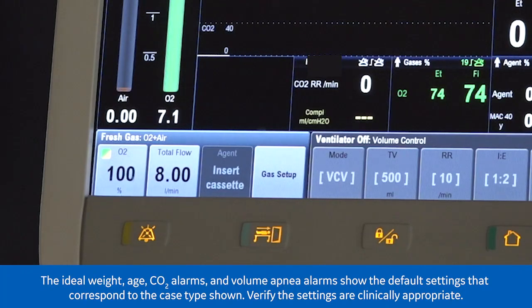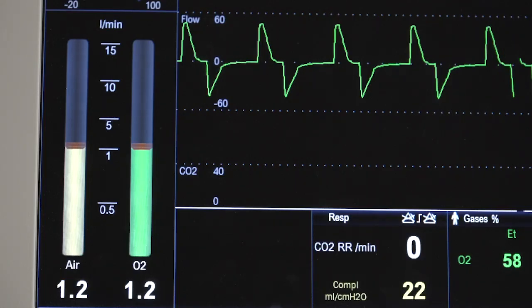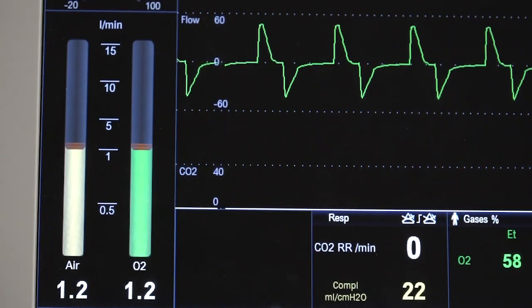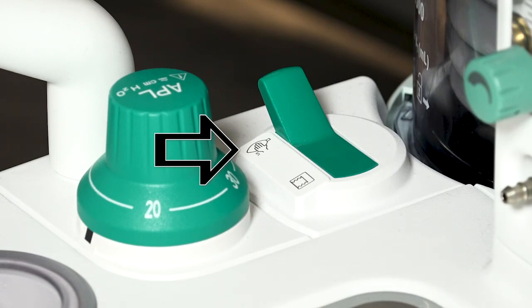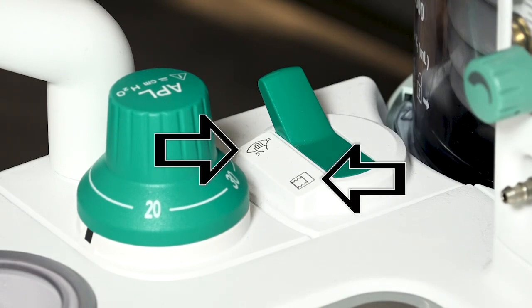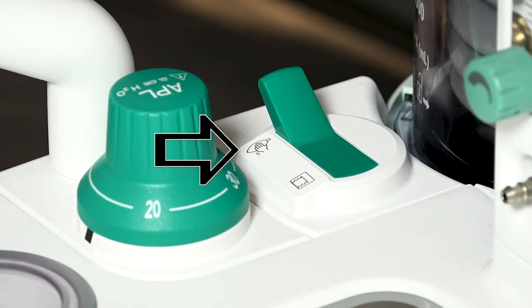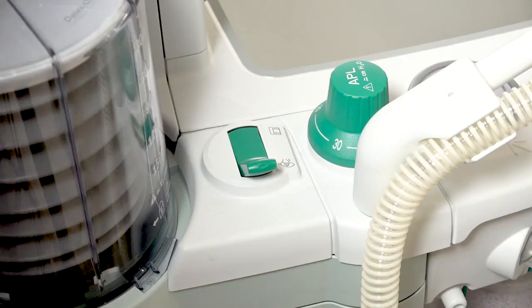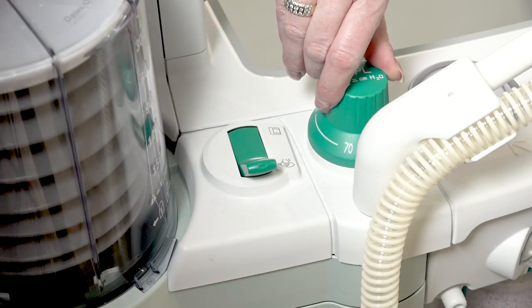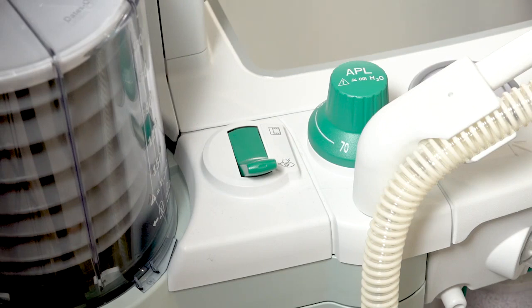When starting a case, always ensure gases are flowing. Anesthesia devices are not automatically configured to begin mechanical ventilation when a case is started. The devices are configured for both manual ventilation, often referred to as bag mode, and mechanical ventilation. When the device is in bag mode, the device is not providing any ventilation support to the patient. When the device is in manual ventilation, maximum pressure is managed by the adjustable pressure limit, or APL valve.